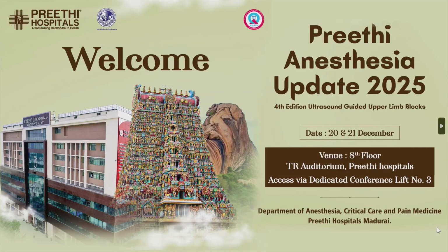Of late, I am in a surgical oncology posting where I see functional neck dissections daily. The prevertebral fascia is a very, very tough fascia. That is why when you advance the needle, you will feel resistance while passing through the prevertebral fascia. In the pre-ultrasound era, the fascial click was based on this prevertebral fascia. When you are above the prevertebral fascia, the chances of phrenic nerve palsy are almost nil. But in case you are not able to identify the prevertebral fascia correctly and you go beneath it, there might be a phrenic nerve palsy.